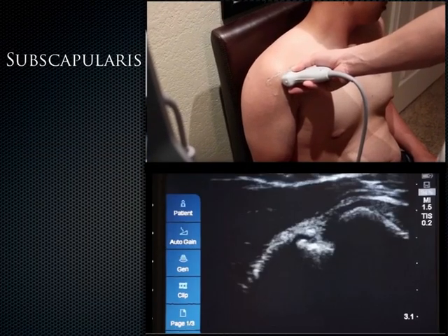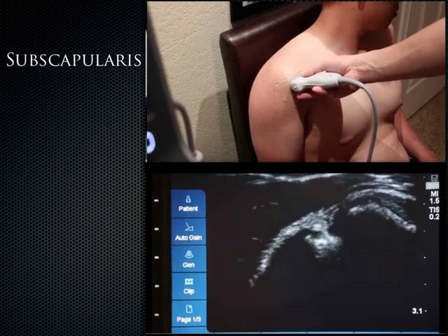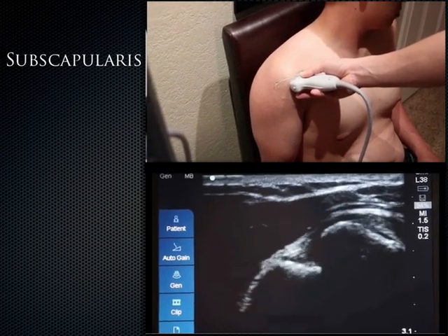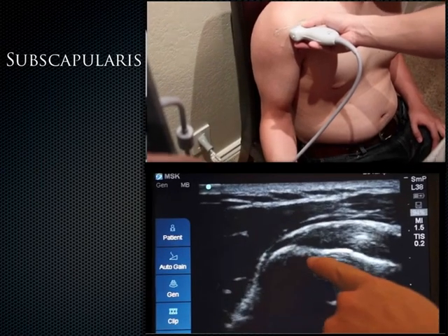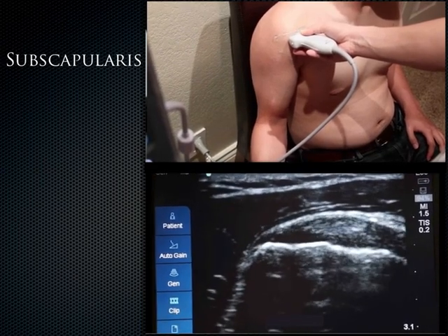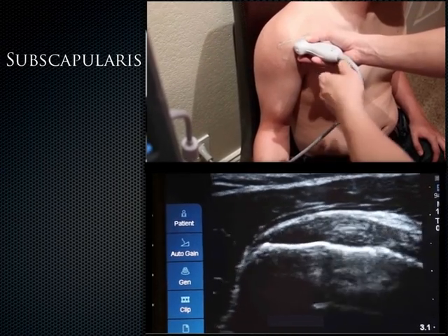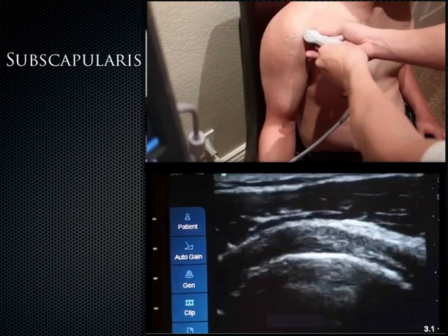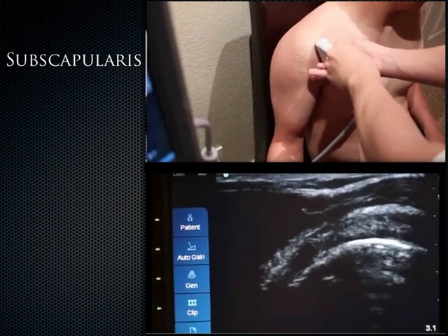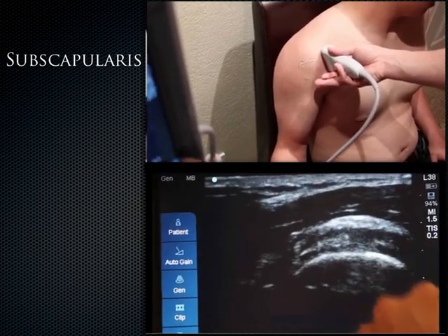Alan Chen. In order to get an image of the subscapularis, remember that the subscap attaches on your lesser tuberosity, which is medial. When I identify the lesser tuberosity up here, I'm going to have the patient slowly externally rotate. When the patient externally rotates, you get the subscap in the long axis view right here. Remember that my probe is still in the transverse orientation. If I want the subscap in the short axis view, I'll rotate my probe 90 degrees, and what I get is the subscap in the short axis view with the humeral head, some of the articular cartilage right here, and then the subscap up on top.